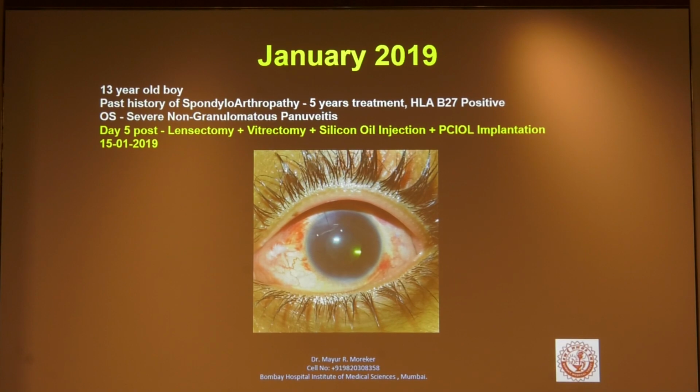And this is the outcome, a very early outcome. This is almost 5 days post-op. The patient has been on follow-up since then and has had involvement of the other eye as well.